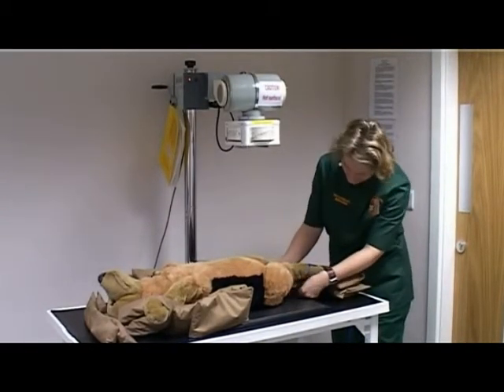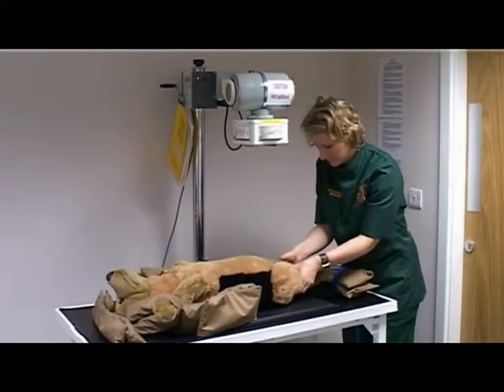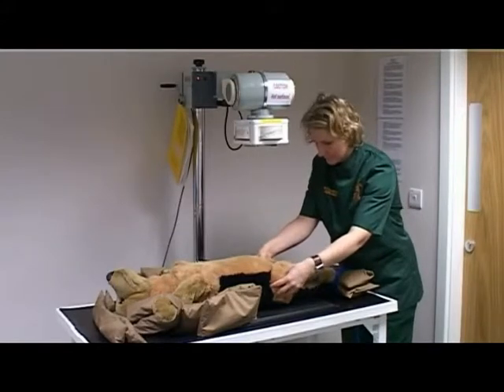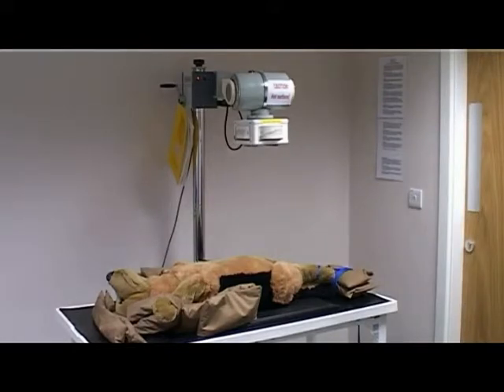Ensure the tail is lying directly in the midline and there is no rotation about the longitudinal axis of the body. Line the tube head up so that the primary beam is positioned over the hips and within the cassette. Centre the primary beam over the pubic symphysis. Collimate cranially to include the wings of the ilium, caudally to include the mid-shaft femurs — this may extend to the patella — and laterally to include the skin surfaces.